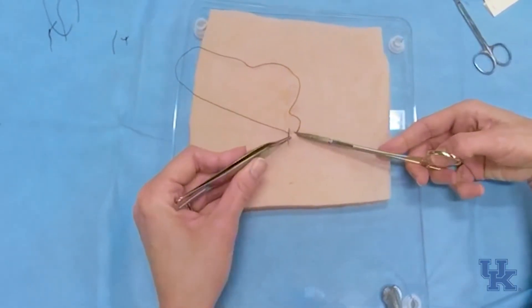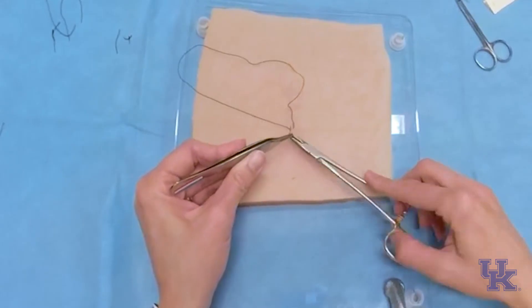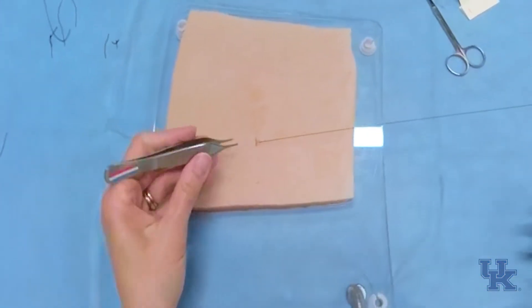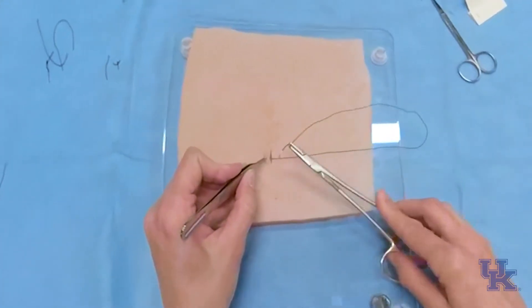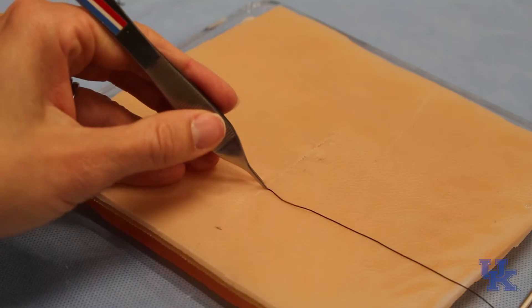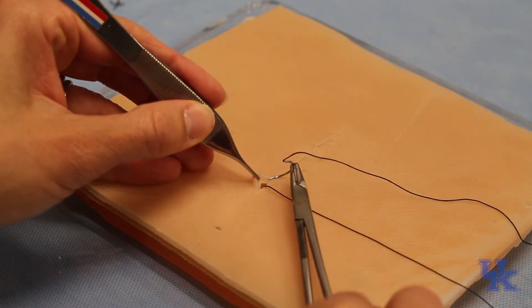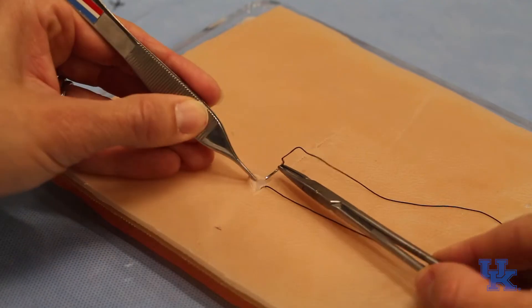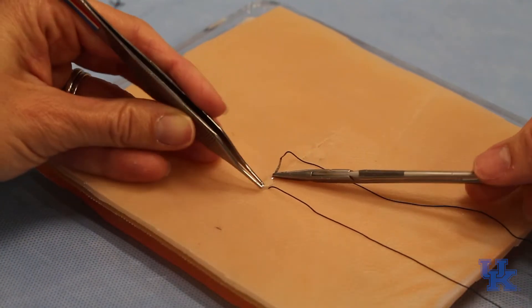As we approach the end, you're going to start thinking about when you need to tie your knot. So we still have a bit of incision on this side. So I think I have the ability to throw one more stitch on this side. I'm going to try to do a little bit of a 90 degree. Rotate out of the skin edge.